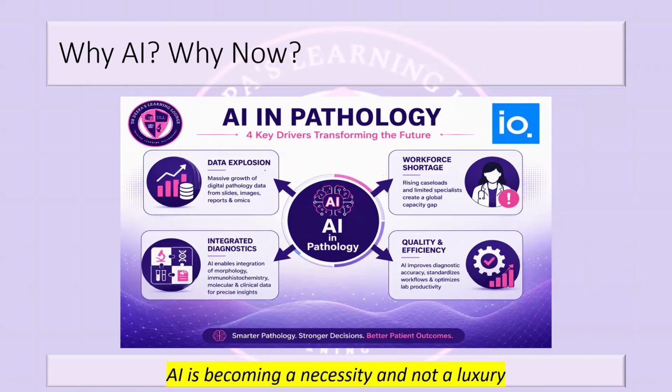Isn't that really bad for the patient? That changes the entire scenario. Eosinophilia will not be treated in the same way as having microfilaria. The treatment changes drastically. You cannot afford to have an inter-observer variability. But suppose it's a whole slide image. You have such a small whole slide image when it is zoomed out that you can possibly never miss that microfilaria, because your whole slide image starts from the scanner view itself, or much below the scanner view actually. So that's how much a difference it can make in your workload.